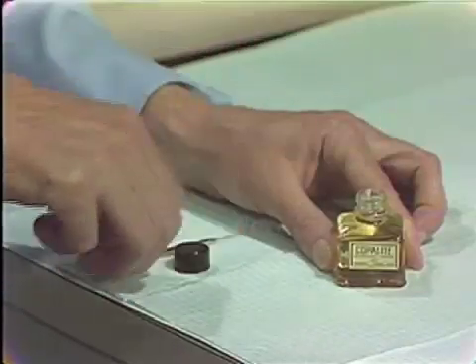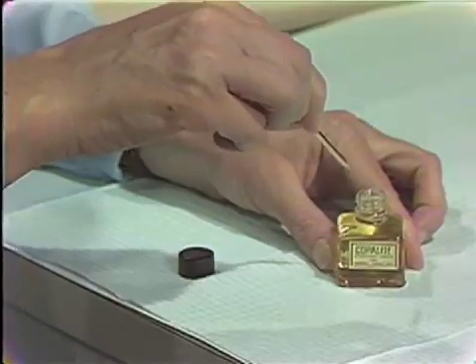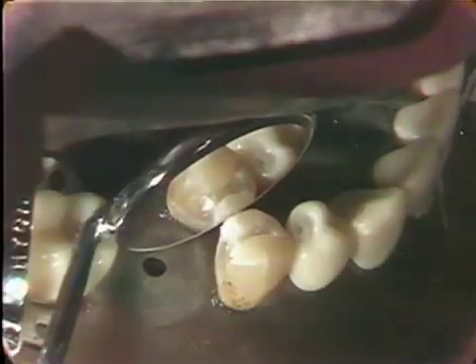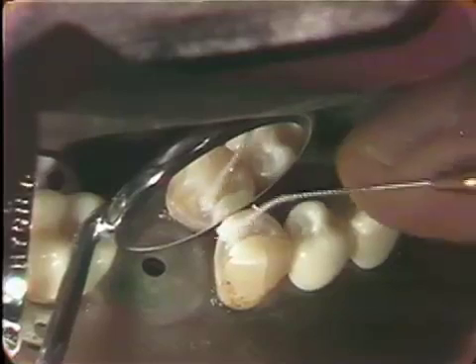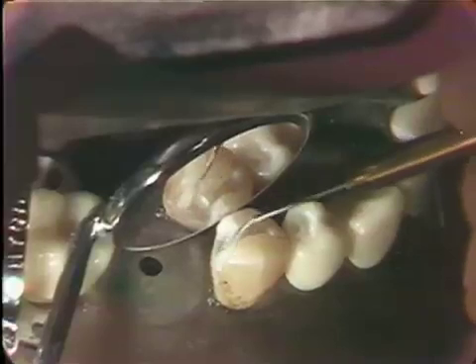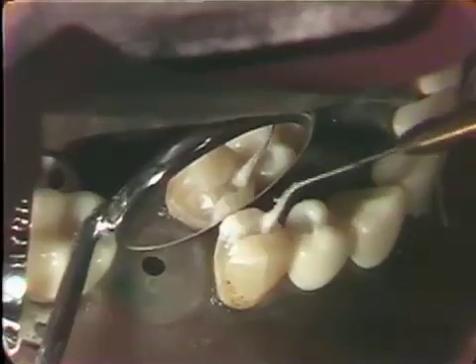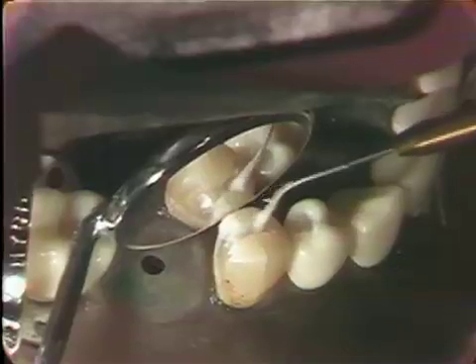This is followed by an application about 30 seconds later of Copalite, a cavity varnish. This is placed on the tooth, over the Cavitec and on the cavosurface margins of the tooth, as you will notice here. We use a root canal file that is bent for the angle we wish, with a bit of cotton attached to it for the application.